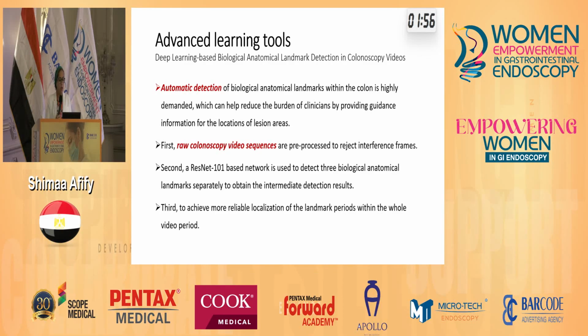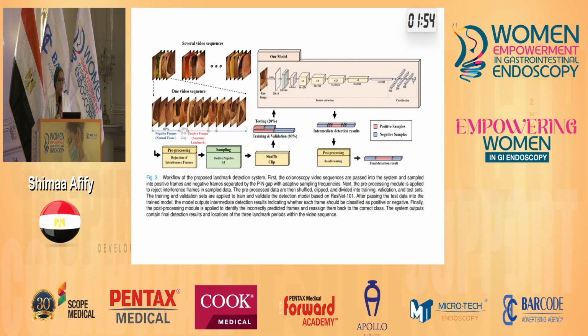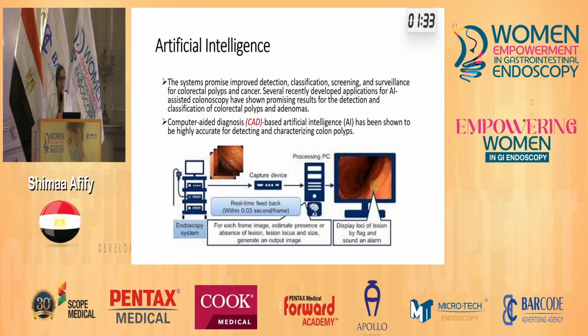Raw colonoscopy video sequences and collections of pictures were given to the AI machine learning systems, and then they created a library of data about how to diagnose the normal mucosa, the abnormal mucosa and the lesions. That makes it much easier for beginners to learn, and also makes it quicker for experienced doctors to achieve more credible results.